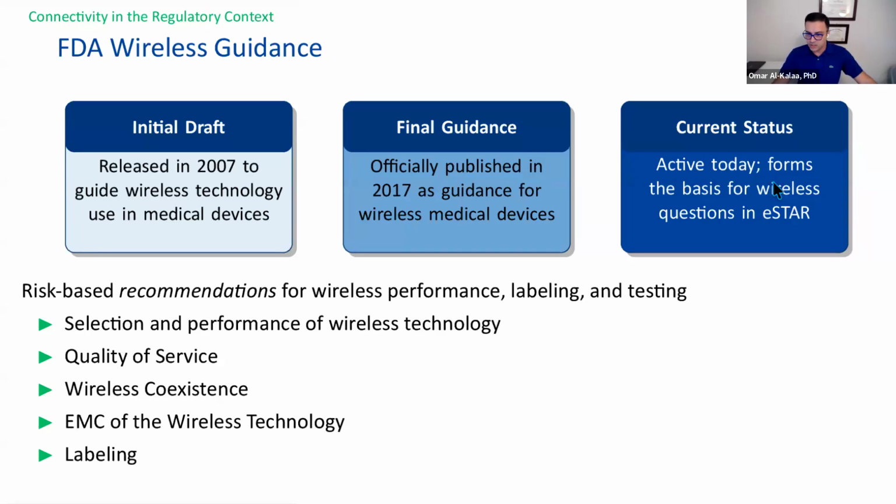That guidance, as I mentioned on the previous slide, is the basis for the questions that you can find in the eSTAR submission. So if you haven't already, and if you're working on a connected medical device, I highly encourage you to go and read that guidance. I think you will walk out by having a better plan for how to develop your medical device.